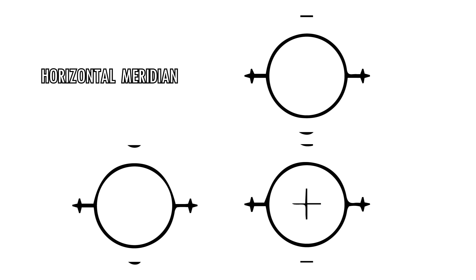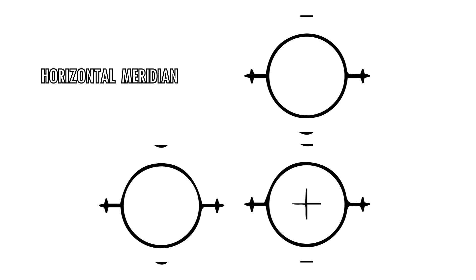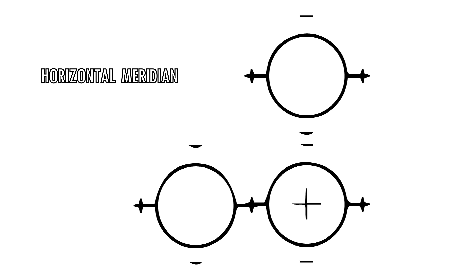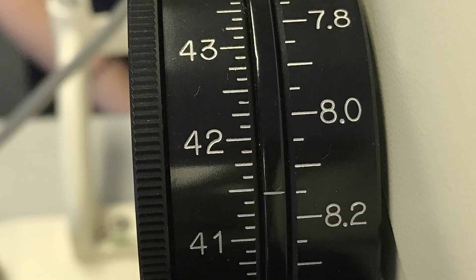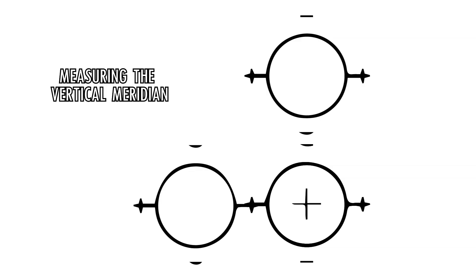After the axis has been established, turn the horizontal measuring drum and the left-hand plus sign will move to the right or left. Move this plus sign until it is exactly superimposed on the plus sign of the central focusing circle. This completes the setting for the near horizontal meridian. The scale of the horizontal measuring drum indicates the actual dioptric power of the cornea in the horizontal meridian. The drum may be left at this position during the rest of the procedure.